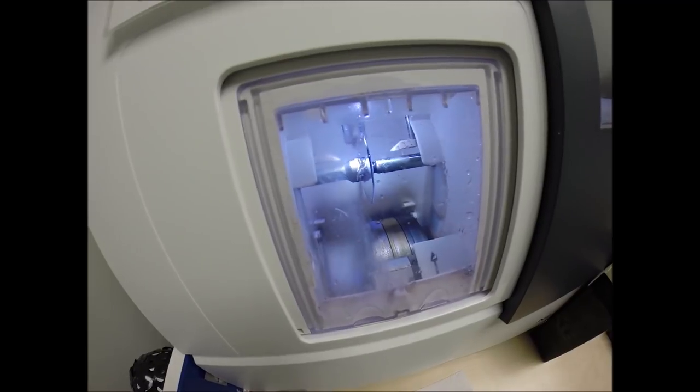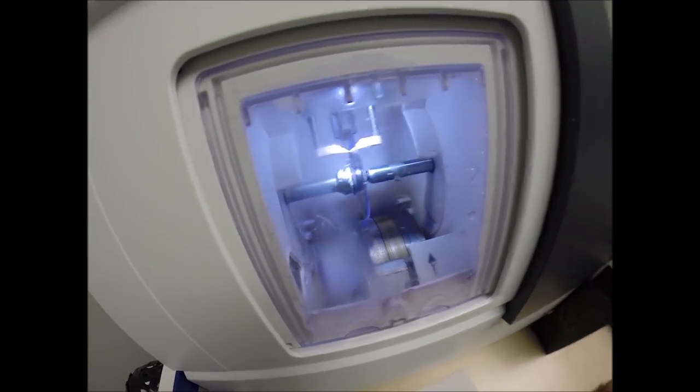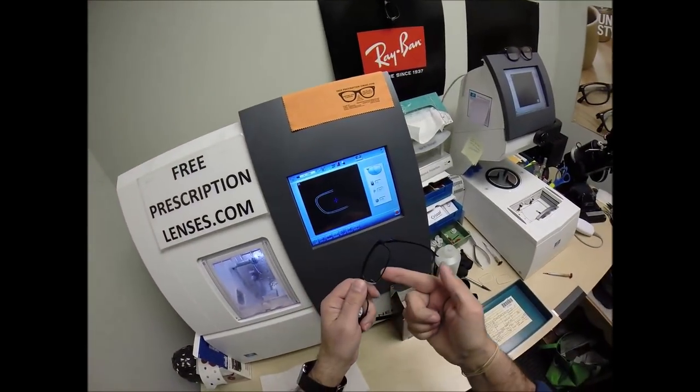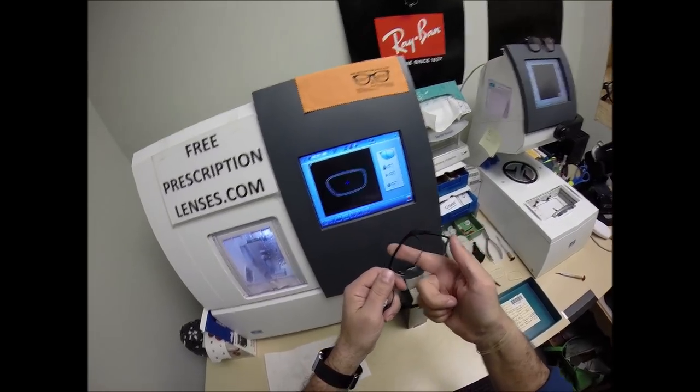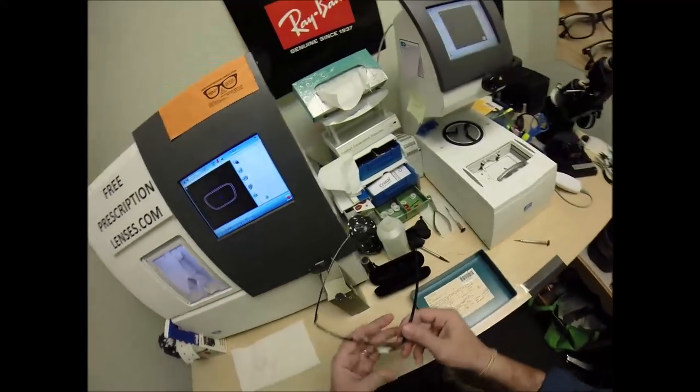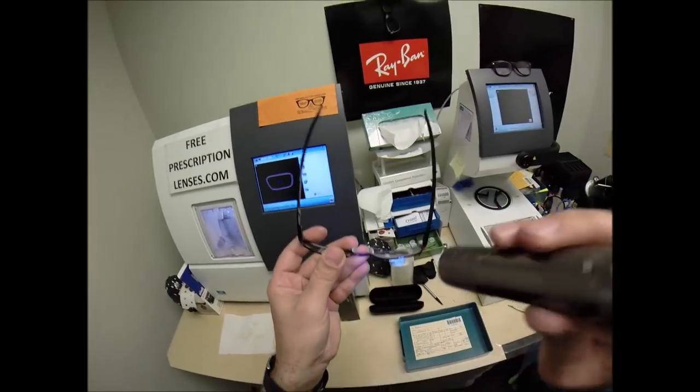Again, first thing, making sure the lens is large enough to fit into the frame. And you can see it's just tracing the left side of the frame. And just like before, measuring the thickness of the lens at every point to know exactly and precisely where to place the bevel, so you have the least amount of edge thickness showing.